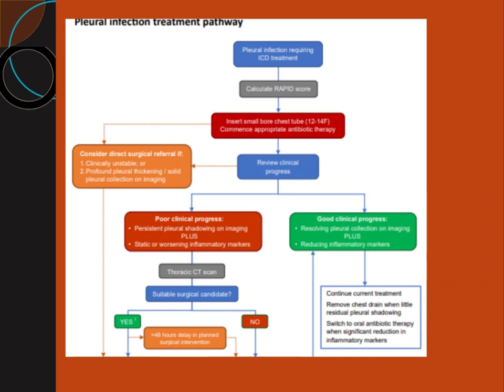In that scenario, just to get an idea, what will be the solution if you initially thought it could be a malignant pleural effusion, or if it is multiseptated, and when to refer to surgeons? I think this slide will give you a proper clue about that.